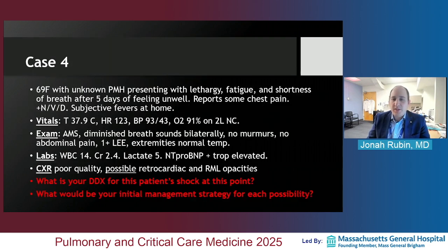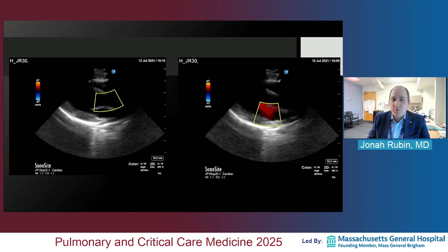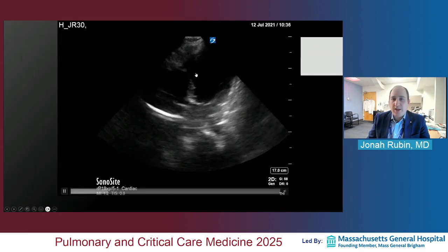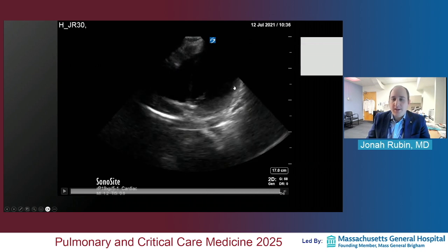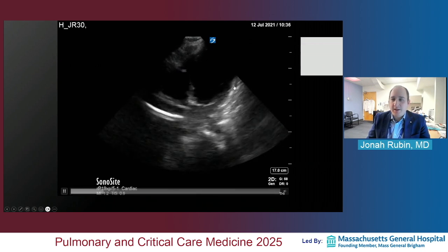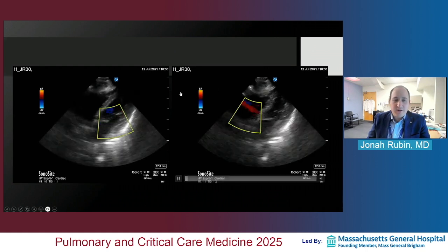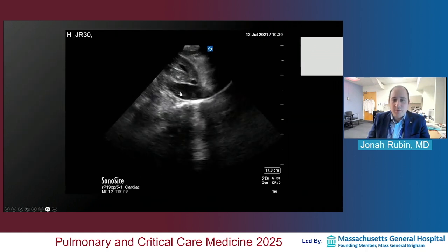In the interest of time, I'm going to skip case 4. It was a case of Takotsubo cardiomyopathy, where you're going to notice the majority of the dysfunction at the apex, where it sort of balloons out. But I'm going to move on from that. I think we've more than covered the very basics, and I don't want to overwhelm or stuff anything into the very last case.